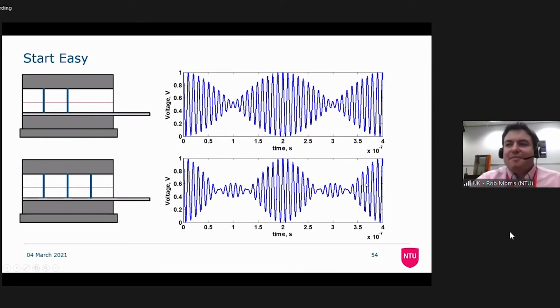Now, anyone that's ever seen an image of the kind of signals which actually come out of the MRI, they still don't really look like this. That's because almost never do we put in 3 infinitesimally thin disks of water, because it's not interesting. We normally have a real sample, and there's this continuous distribution of frequencies all through it. They interfere with each other so much that you just have this kind of bloop, and it drops off and you can't really see anything. All you get is a bit of the fundamental wiggling which we've got going on there.